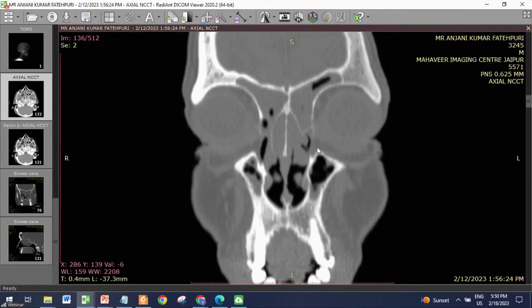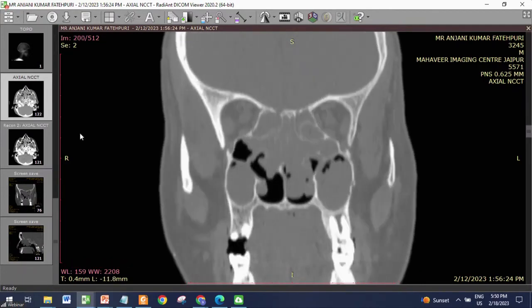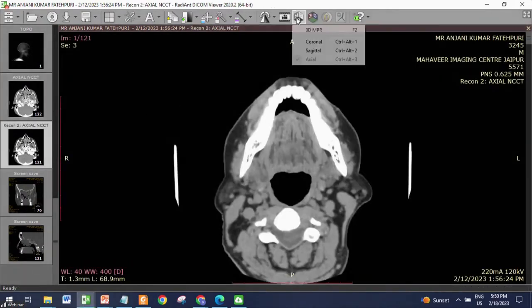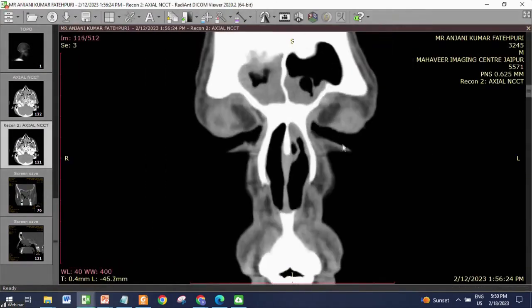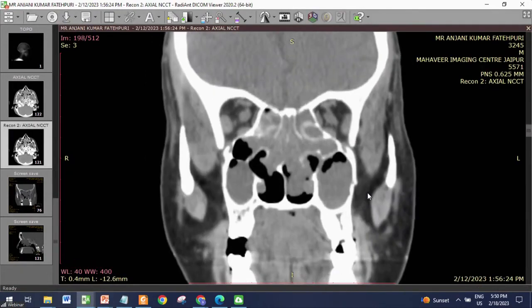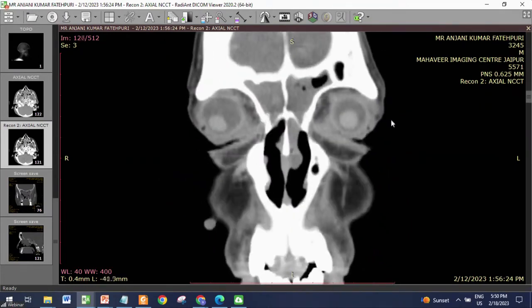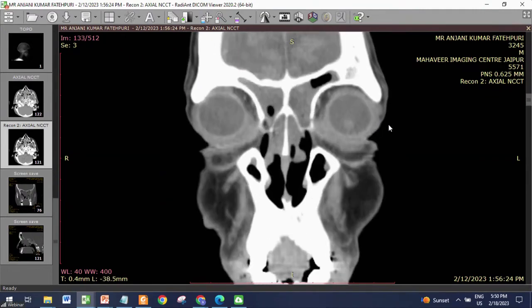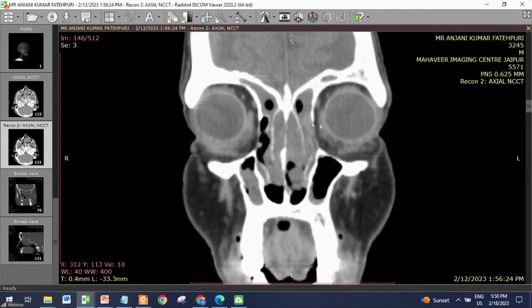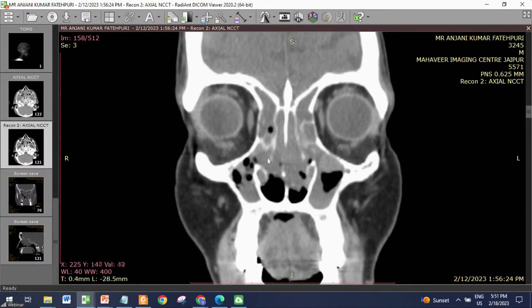Sides we have seen so far. So one side I am going to demonstrate here, and I am going to show you certain positive findings in this case. This particular patient has a pansinusitis. This is pure eosinophilia. See this frontal, hardly any challenge. Good frontal sinuses. This is the beak. This is the frontal drainage. See the turbinates. Can you see? Turbinates lateralize, and a lot of disease medial to the turbinate. Again, can you see this?